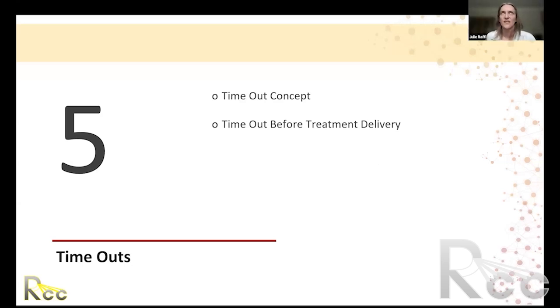Yes. So it depends on how often you're imaging, your imaging frequency. If you're imaging every day and you're comparing your images with your reference image, every day you might have slightly different shifts. The patient might be on the table just slightly differently, but we might be aligning to their bony anatomy, getting it fine-tuned. So those shifts might be a little bit different every day. And that's okay because we're trying to align to their planned position.